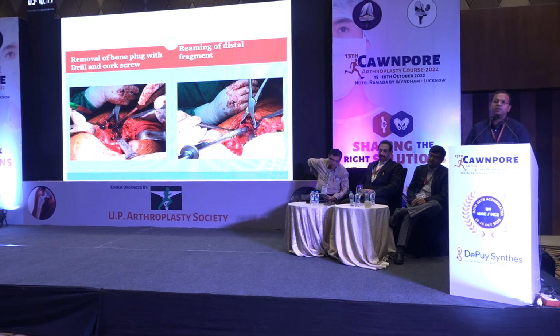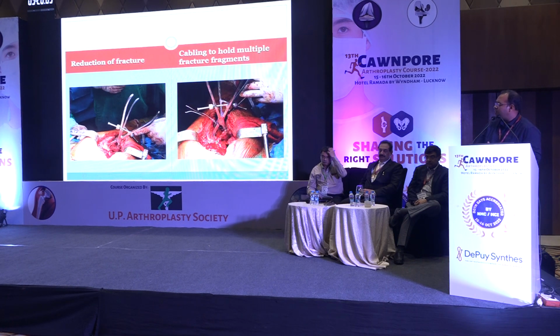So like a trauma concept, we have to bring these moving pieces together to smaller pieces, single moving pieces, and then kind of couple them together. So first of all, we reamed the distal fragment and took a provisional size. Then we used the forceps for reduction of the fracture, and we used cables instead of SS wires, and I found cables have a better hold than the SS wires.